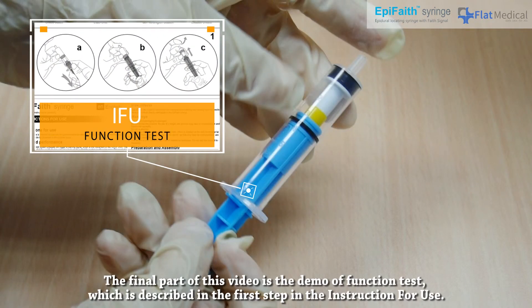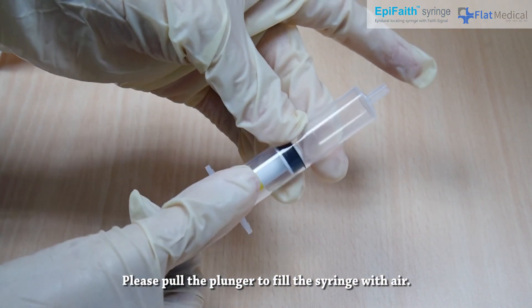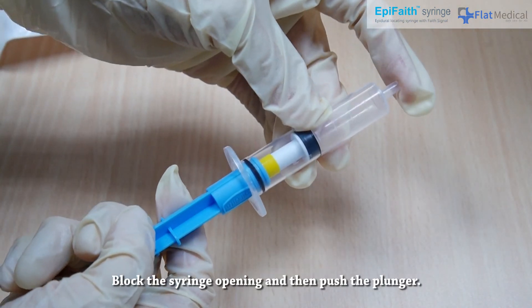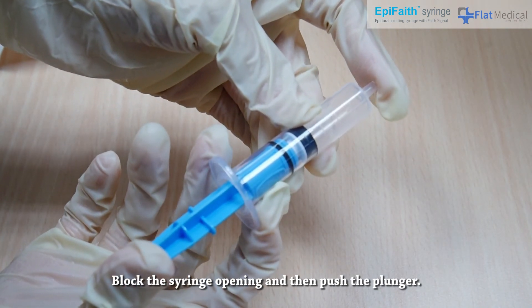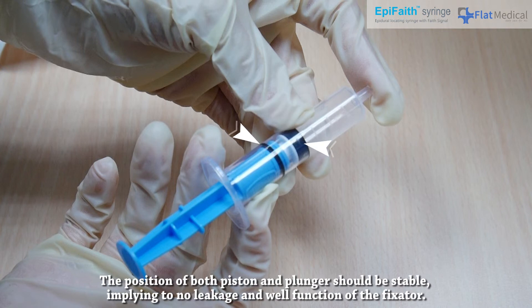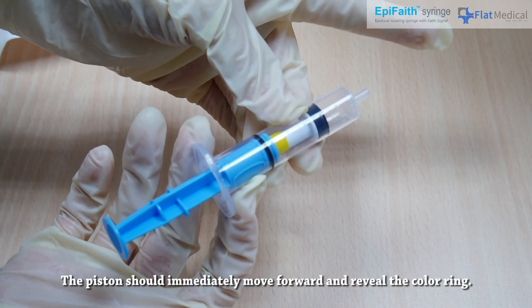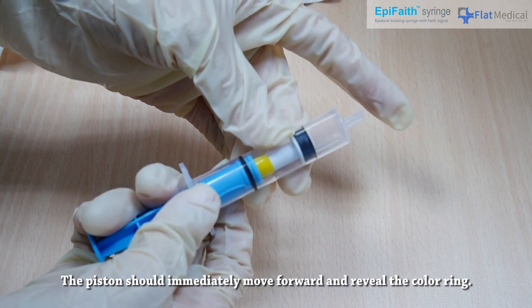The final part of this video is the demo of the function test, as described in the first step of the instructions for use. Pull the plunger to fill the syringe with air. Block the syringe opening and then push the plunger. Maintain the blockage and release the hand on the plunger. The position of both piston and plunger should be stable, implying no leakage and well-functioning fixator. Then release the syringe opening — the piston should immediately move forward and reveal the color ring.